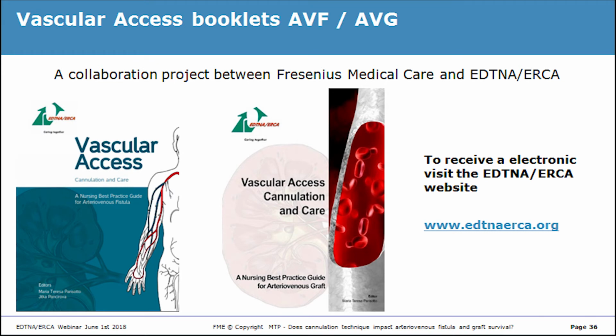But there are some studies that I read recently, published by somebody from Canada and somebody from Australia, demonstrating really that there are fewer complications with Teflon cannula than with a metal needle. I think that in the long run, we will go in that direction. Because if you look at the needles used in other departments outside dialysis, in almost no department are metal needles used anymore. They are all using plastic cannula or Teflon catheter, call it as you like. So we hope to have more information also from Europe. But as I said, here we do not have so much information, but Canada, Australia, New Zealand, yes.